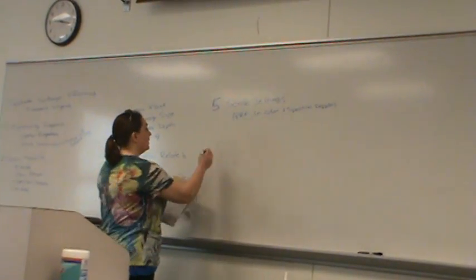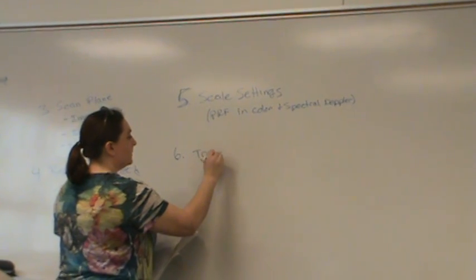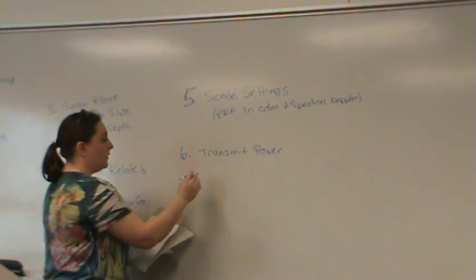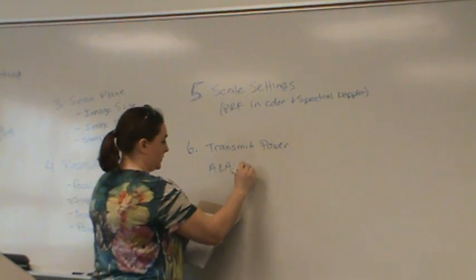And then the last one on here is my transmit power. So this has a lot of other names.